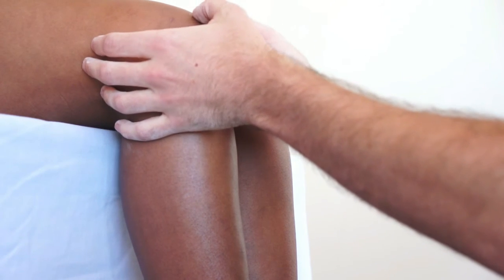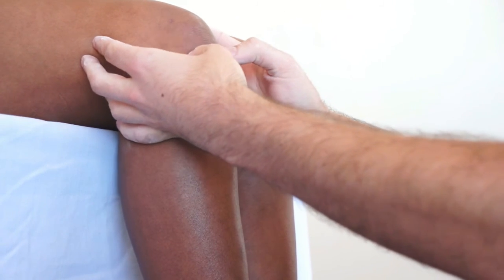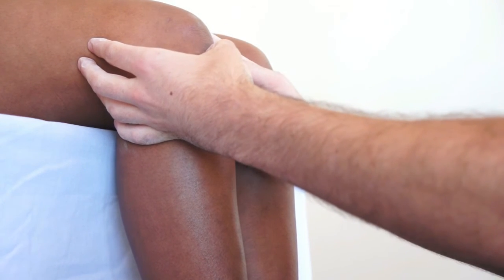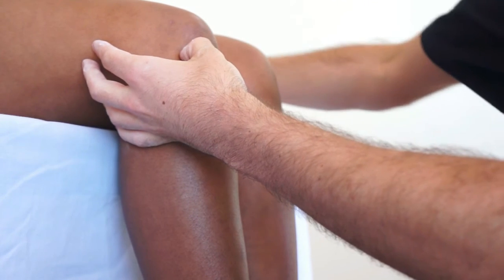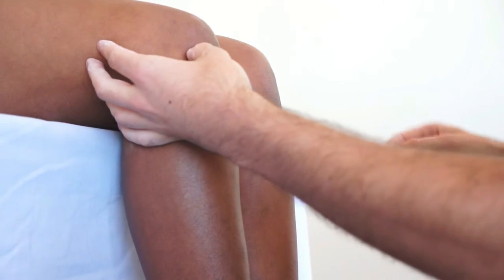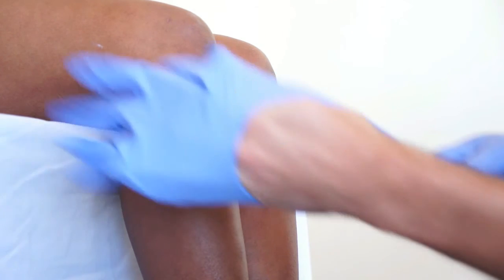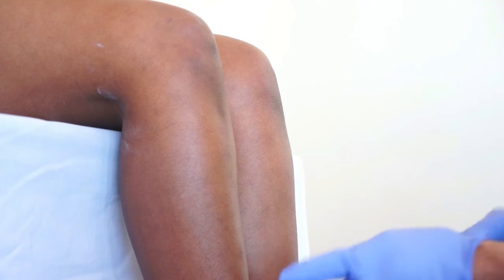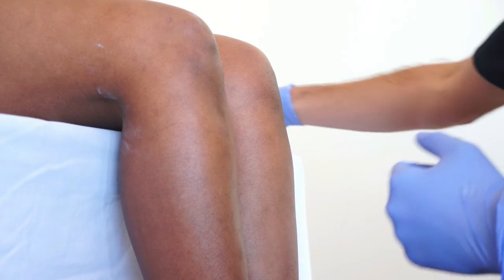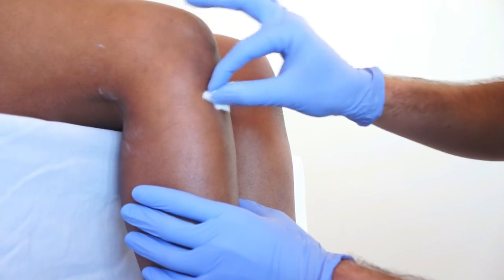Start by locating the injection site. Palpate the patella for its inferior aspect. From this point, move approximately one centimeter inferiorly along the patella tendon, and then one centimeter laterally from this point, where you will feel a soft spot. Use the blunt end of the needle cap to mark the skin where your injection site is located. The clinician should be gloved and comply with an aseptic technique. Once gloved, begin by cleaning the area using a three-swab technique, which entails starting at the center of your injection site and spiraling outwards. This is to be performed three times.